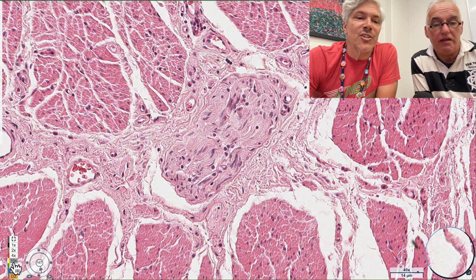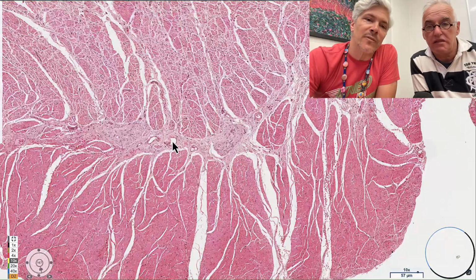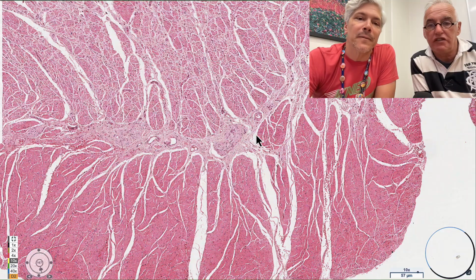Right, and you can even see the change in the density of the staining there. It's much lighter and pinker. It's rather beautiful, actually. Yeah, a lavender nerve. Dude, that's really pretty good.